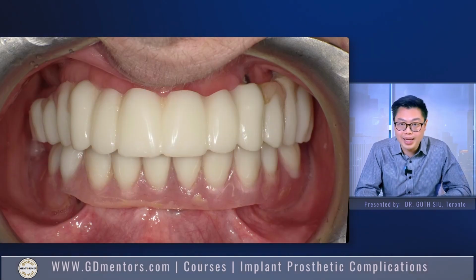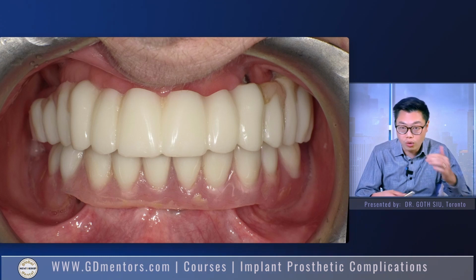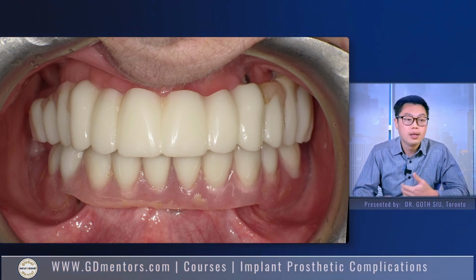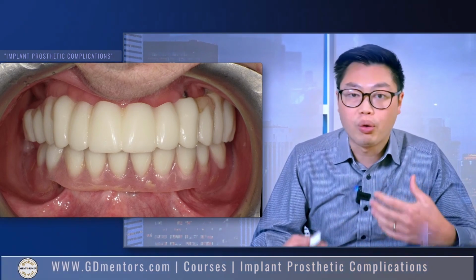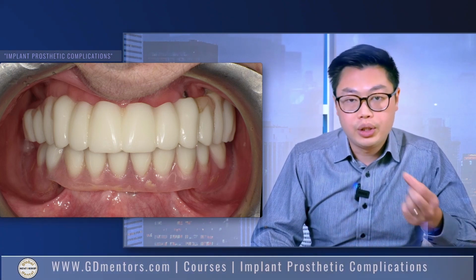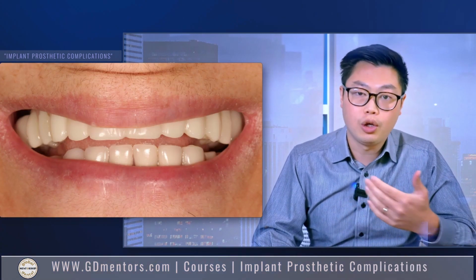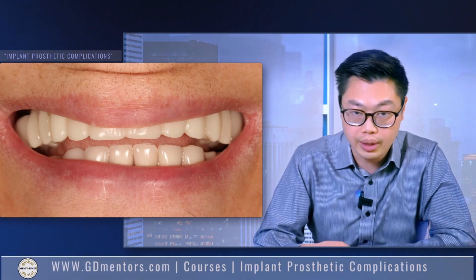So we look at a case like this. This dentist was trying to actually get something that the patient's gonna be able to tolerate. Unfortunately, this patient is a very poorly adaptive patient. The implants are already in. And if we look internally, in a retracted view, it's not so bad. But if we actually look back and look at the smile, we see there's a lot of things that need to be altered here, right?